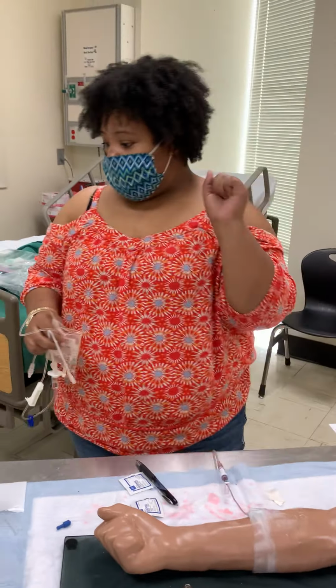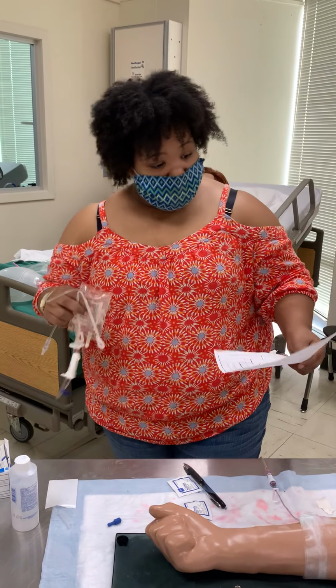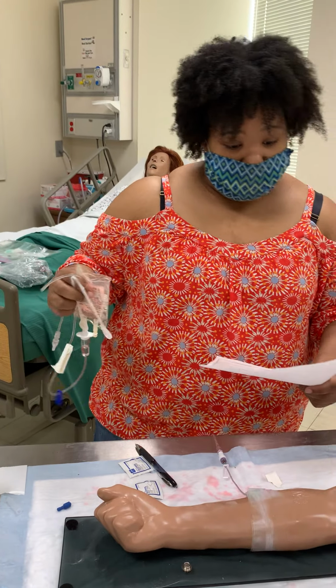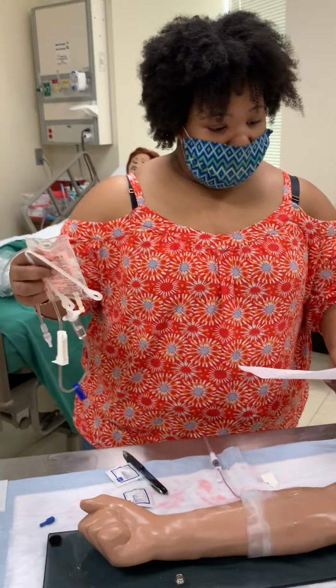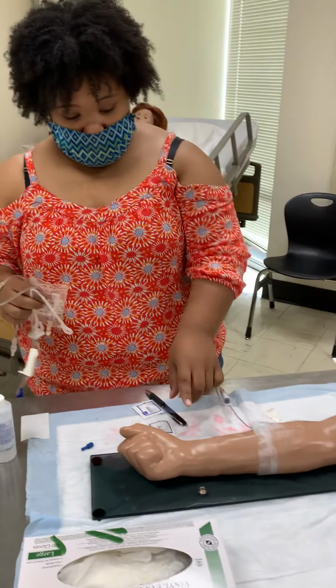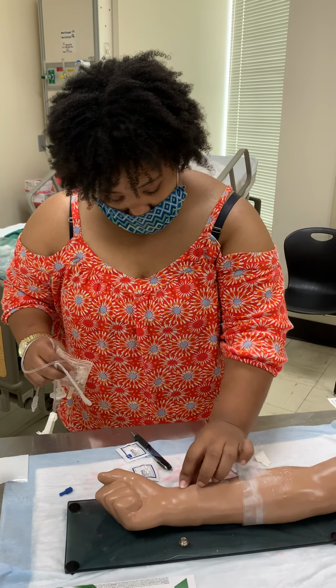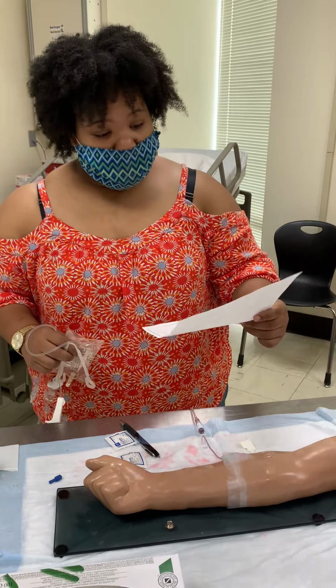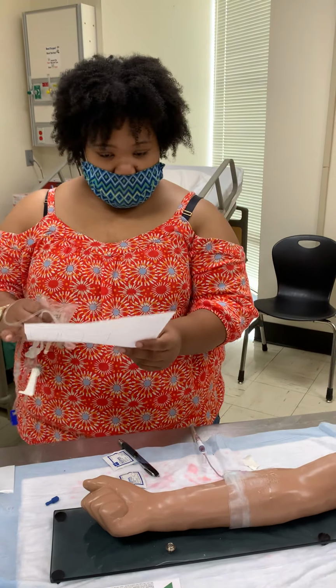So, knock knock, can we come in? I'm going to explain my procedure. My name is Amber Jones. I'm going to be giving gentamicin to you today. It's IV piggyback. Can you tell me your name and date of birth? They tell me their name and date of birth. I'll compare it with their armband here. I also look at my MAR. And I'm going to ask them, do you have any allergies? And I said they have none.